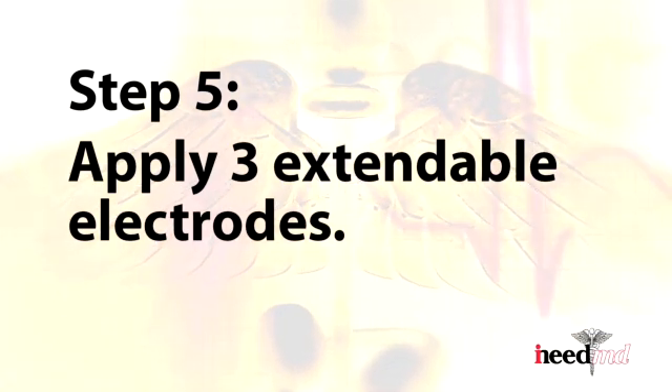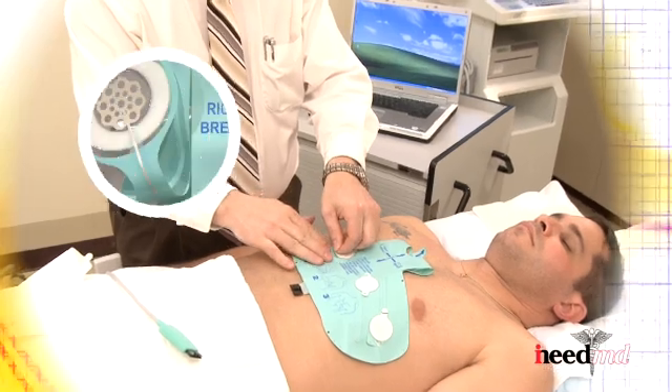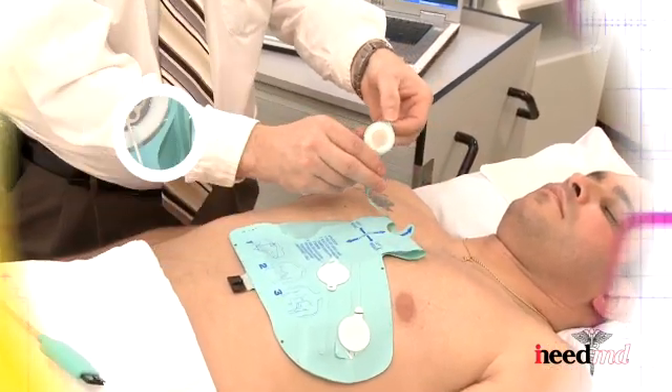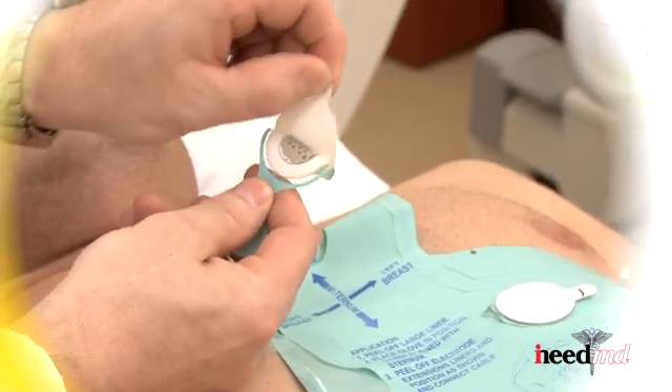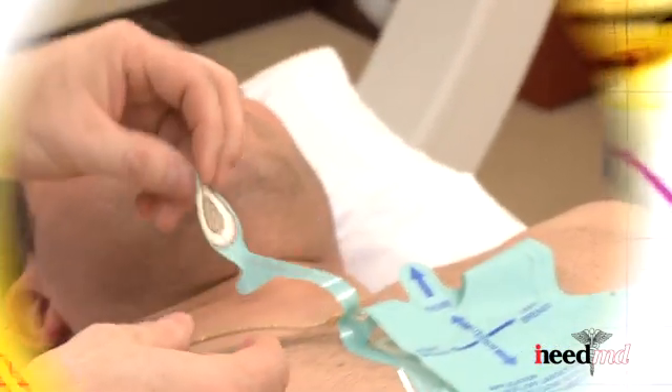Apply the three extendable electrodes. Although the order is not important, we will begin by lifting the tab noted RA and pull away from the glove. Remove the white release liner covering the electrode and place the electrode below the right collarbone.